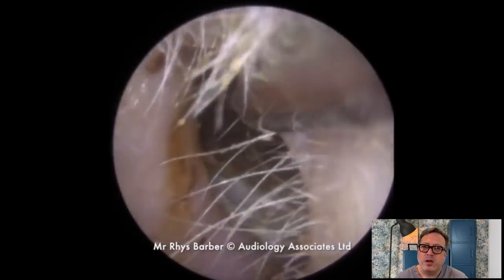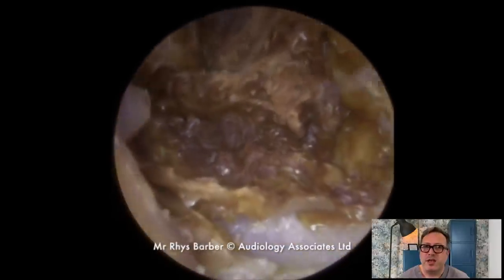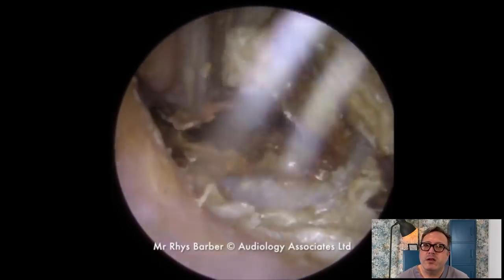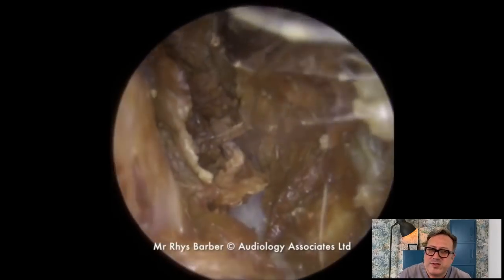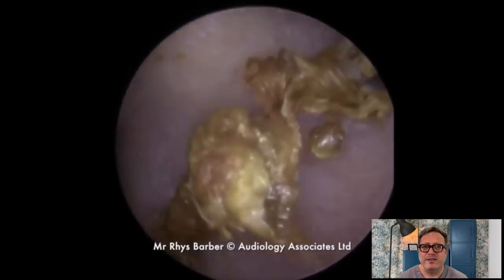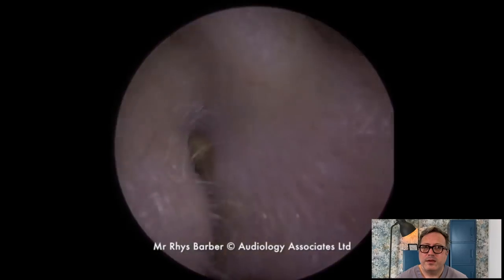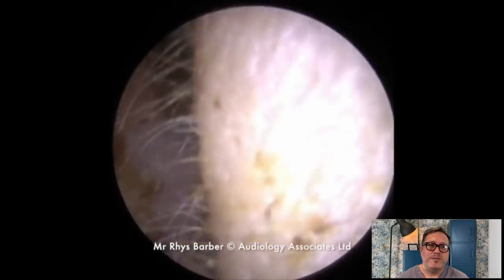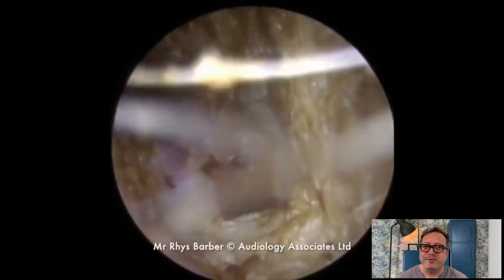We've hit a more solid piece now. I remember that the gentleman was sat in the chair for quite some time having this done because it was kind of a painstaking procedure. That's one big piece of skin — it flexed the whole back section as well. Another thin plate coming away — see how it peels off? It's almost like scales coming away. This has probably been in here for quite some time. I remember this gentleman actually came in a couple of years later just for a checkup, and he said he realized his ears were quite famous because they were on YouTube.